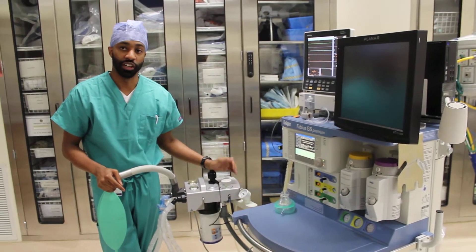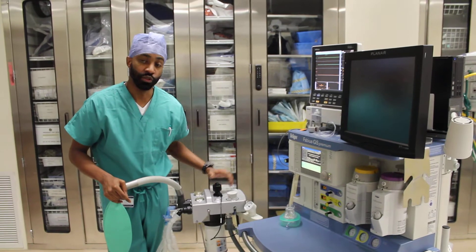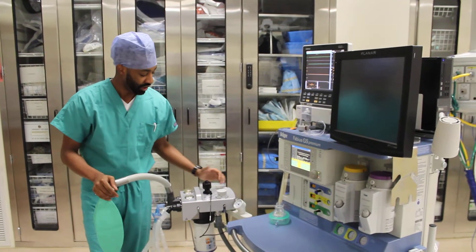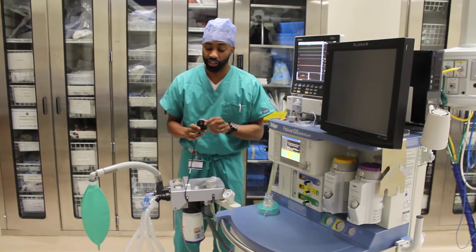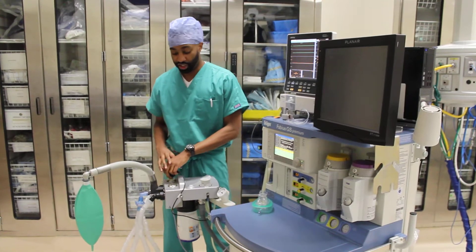The first thing we do is calibrate our O2 sensor. Here we open this and expose it to room air, and then we're ready to begin to calibrate our O2 sensor. This is a good time to check your O-ring to make sure the integrity is intact before reinserting it into your machine.